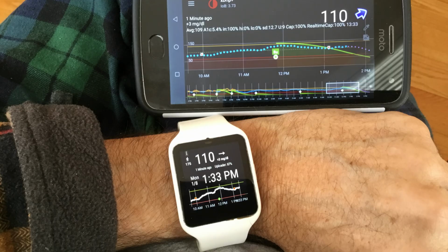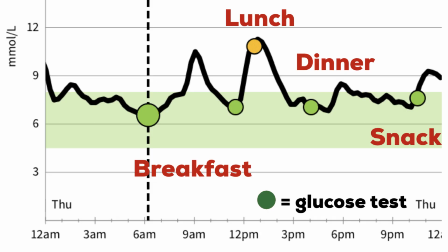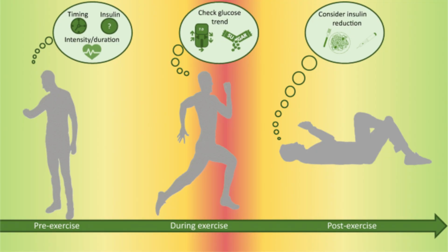You do not need to draw blood to check your blood glucose, and you can set alarms to alert you if your blood sugar levels are too high or too low. It also allows you to know how your blood sugars are doing in relation to eating, exercise, stress, so you can adjust your insulin medication accordingly.